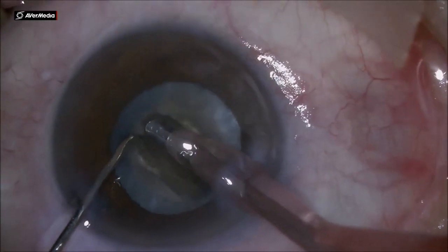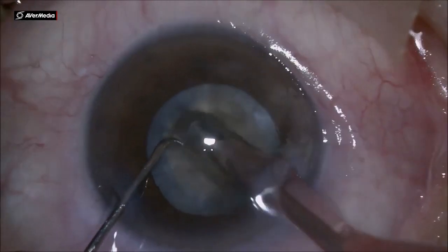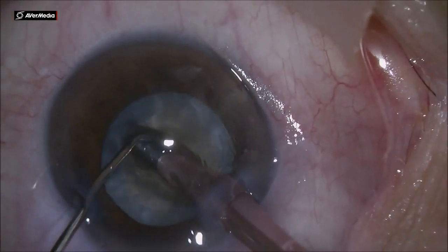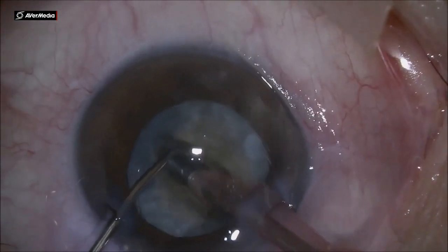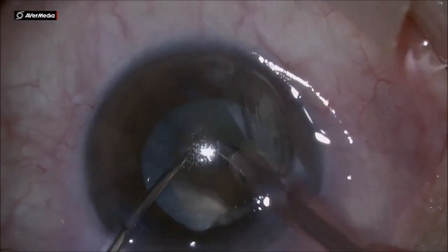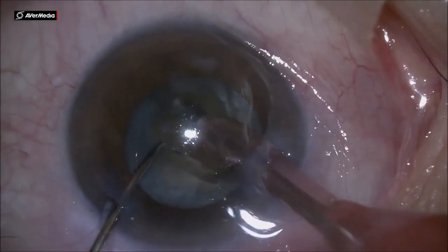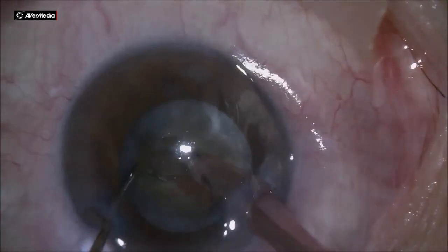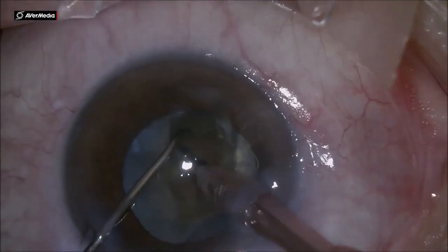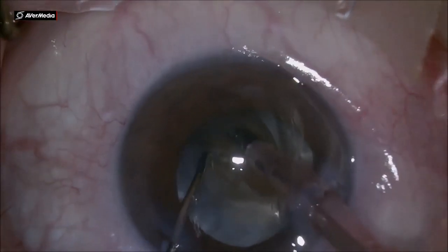The only difference is that we have to repeatedly replace more viscoelastic into the anterior chamber to protect the cornea. In this case especially, because we have a very shallow anterior chamber. Having this leathery nucleus in a shallow anterior chamber will force us to do most of the phaco emulsification inside the bag, or at the iris root at most, which is very close to the cornea.